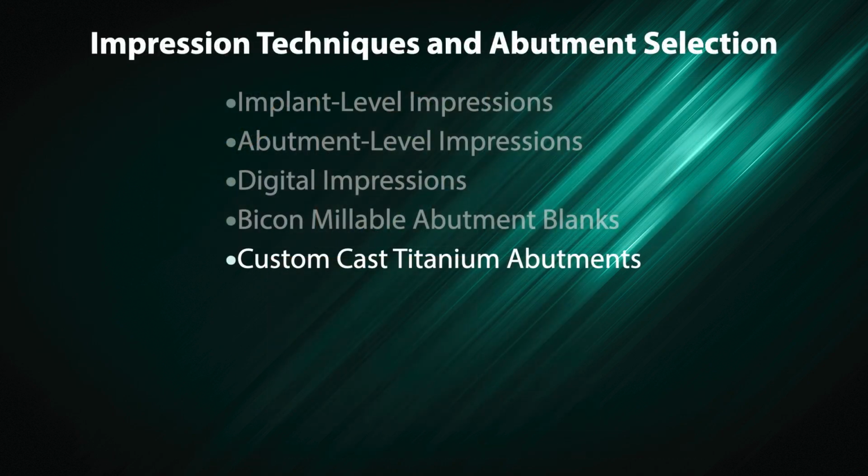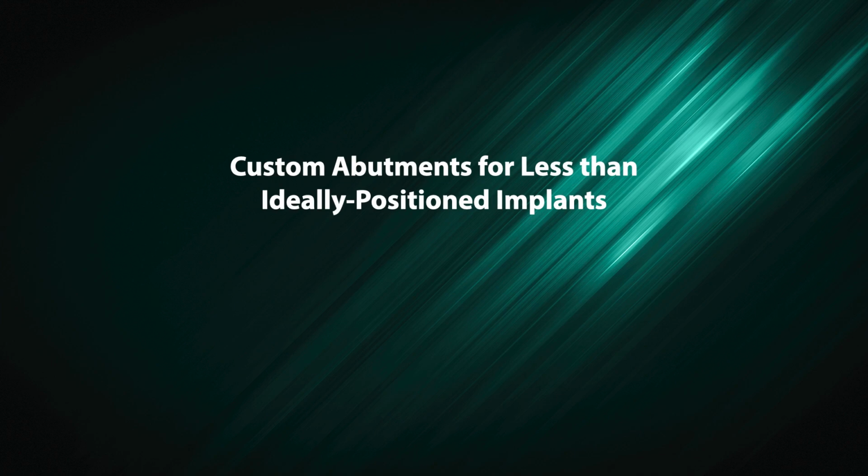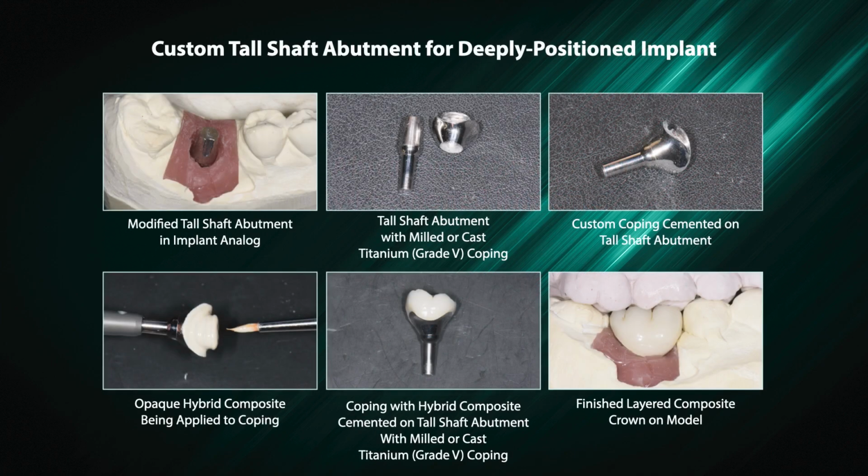Custom cast titanium abutments. Custom abutments for less than ideally positioned implants. Custom tall shaft abutment for deeply positioned implant.